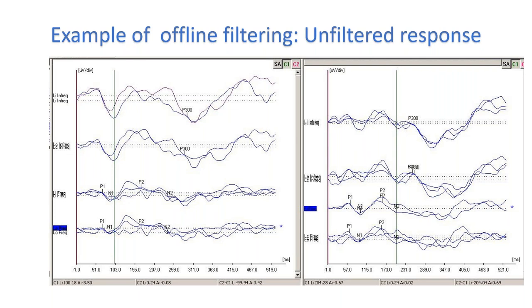There are also a couple of comments, ma'am, added to the question asked by Dr. Chandan regarding different speech stimuli. Mr. Narendra has commented that in his experience high frequency stimuli give better latency and good morphology, for example da, ta, rather than ma or ga. Ta gives the best response. Incidentally, even with ma, I've got good responses.